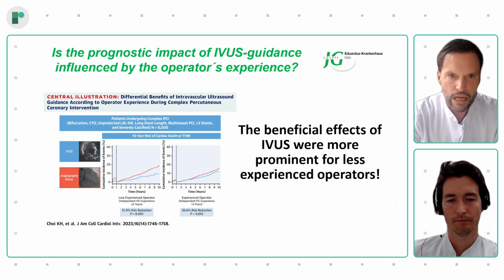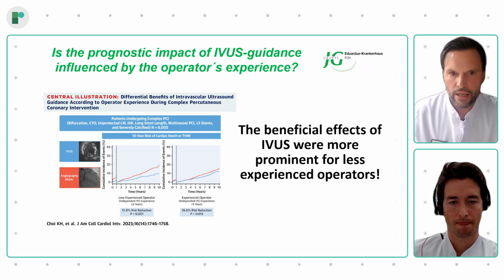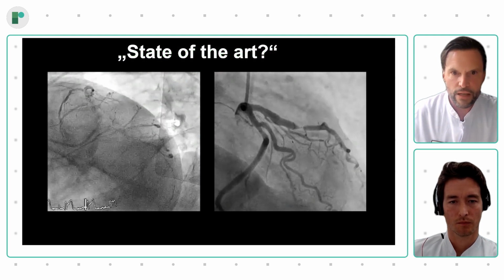And this can be clearly seen with IVUS. This is a clear message that it should not be restricted to experienced operators alone, that this should be routine use of intravascular imaging in every cath lab, especially by non-experienced colleagues.